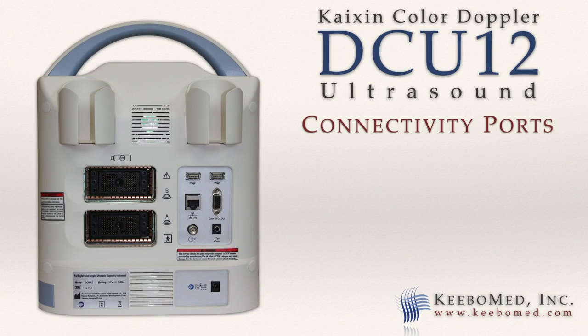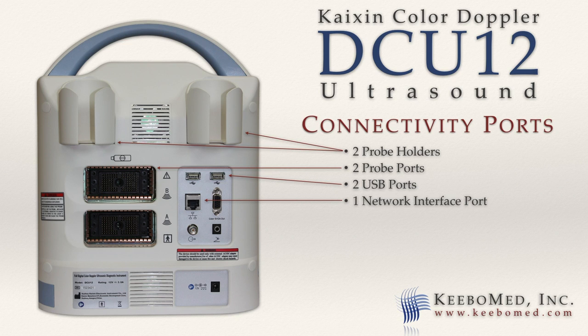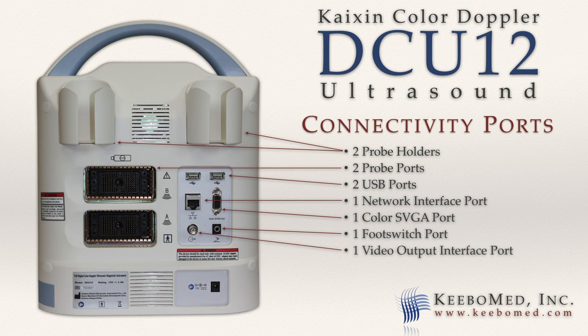The rear of the DCU-12 features 2 probe holders, 2 probe ports, 2 USB ports, 1 network interface port, 1 color SVGA port, 1 foot switch port, 1 video output interface port for use with a video printer, and 1 12-volt power input port.